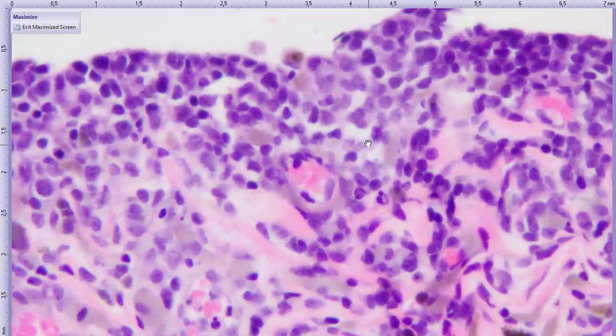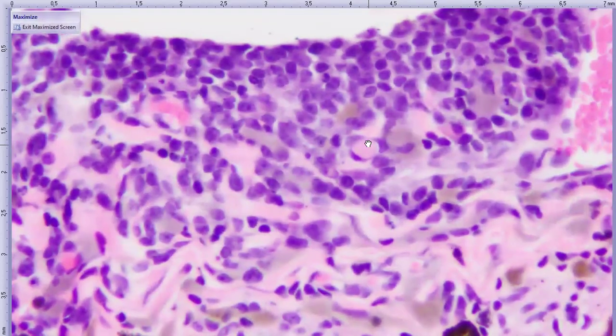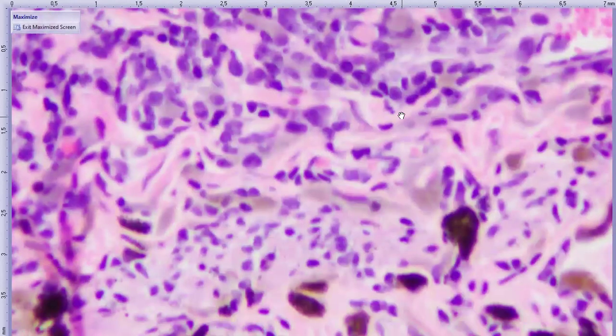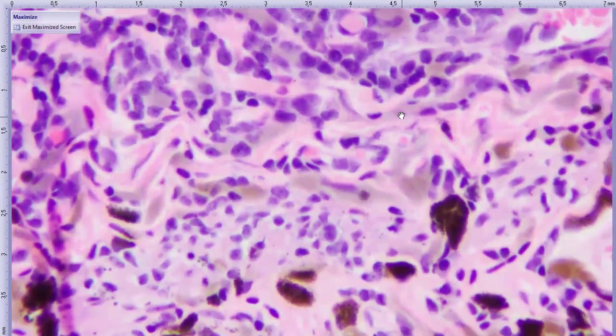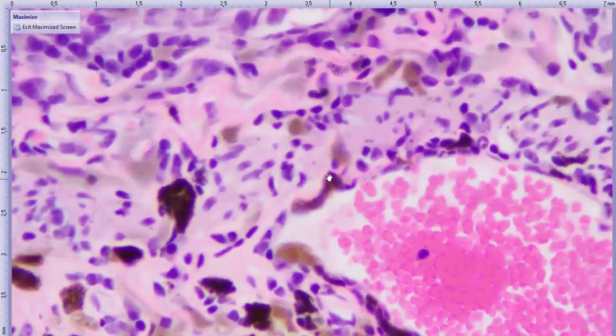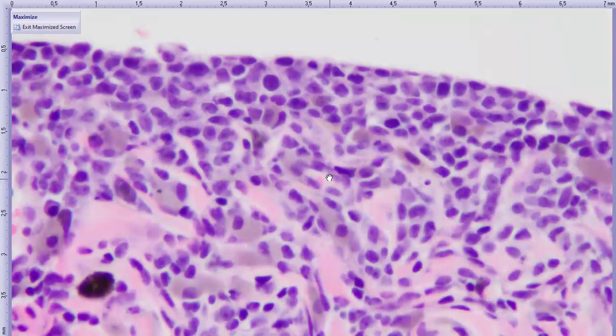So we were definitely concerned for a neoplastic population in cats, especially feline diffuse iris melanoma was on our list, but we also couldn't rule out that maybe this represents lymphoma. There are a few non-neoplastic lymphocytes and plasma cells scattered around in the stroma as well. So there's a very mild anterior uveitis in the background as well.